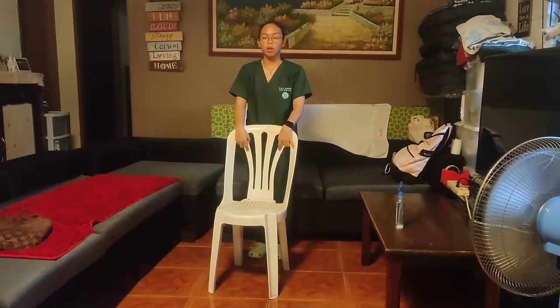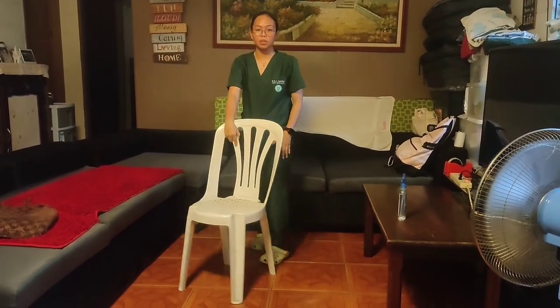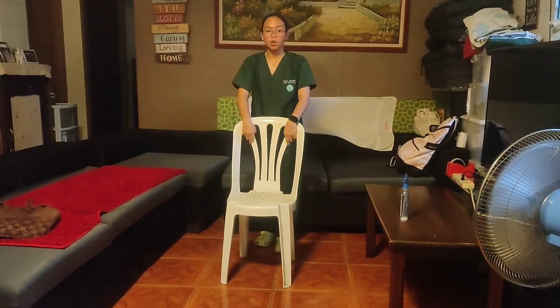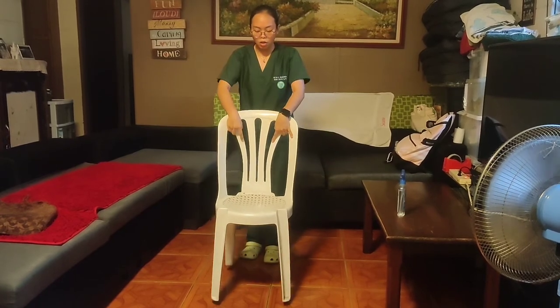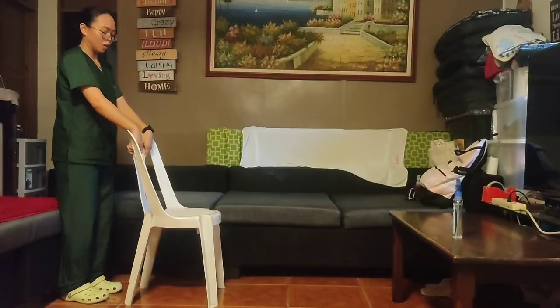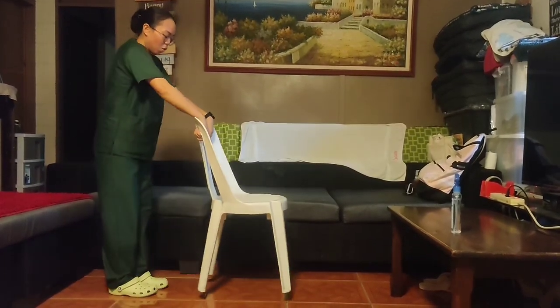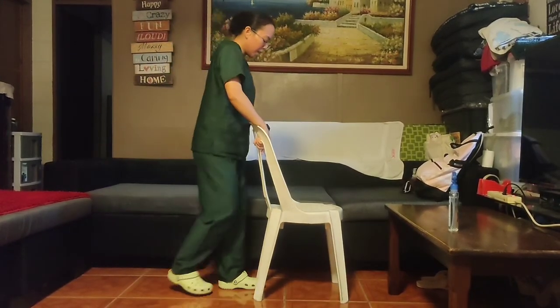Using a walker, advance the walker first, then proceed with the weaker side of the leg, then the strong side. The pattern repeats: walker forward, weak side, then strong side — continued throughout ambulation.